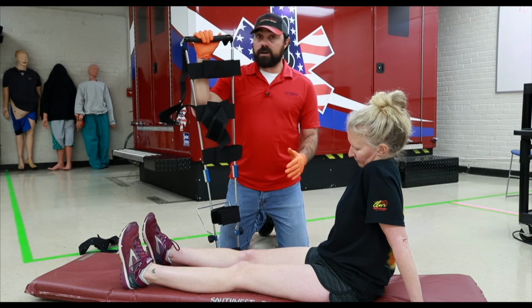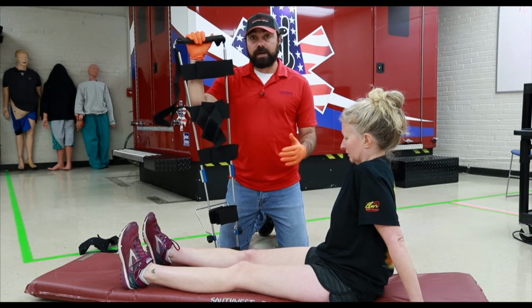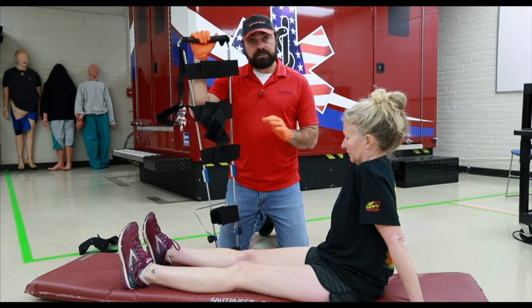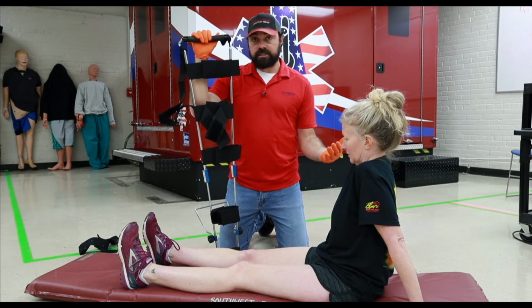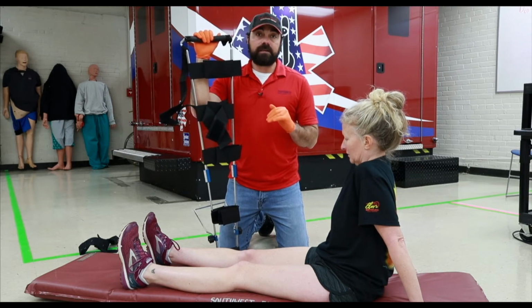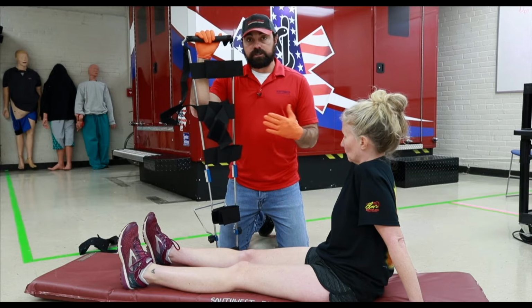It's a very rare occurrence that all of those factors come in because it's the largest bone in your body. So to be able to break that in mid-shaft, it's a very unique situation, but I have used it, so it does happen. The purpose for this splint is to, one, of course, splint the extremity to prevent further injury, but then also your goal for pulling traction is to relieve pain, because what starts to happen is those muscles start to contract and have spasms, so you're just trying to relieve pain as much as you are splint it.